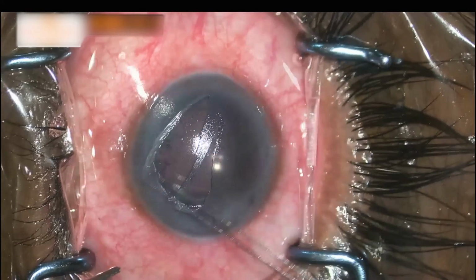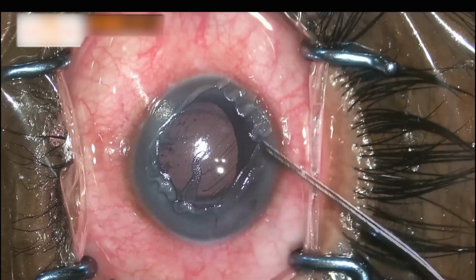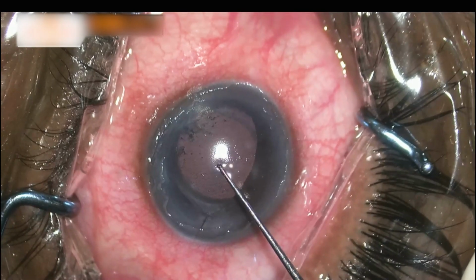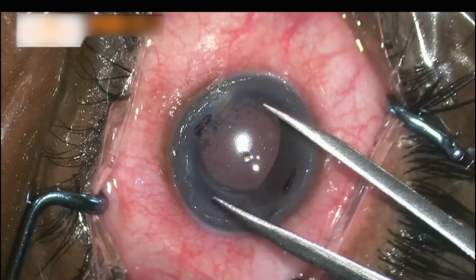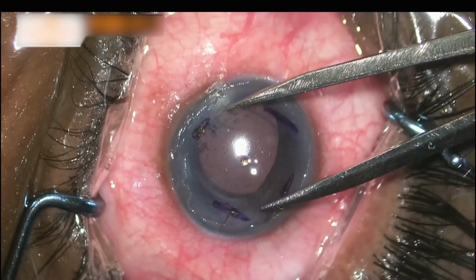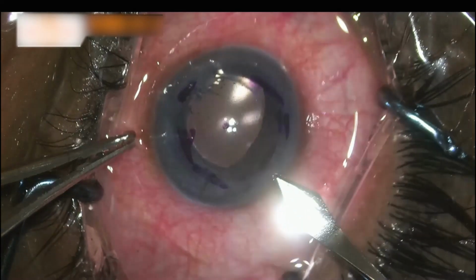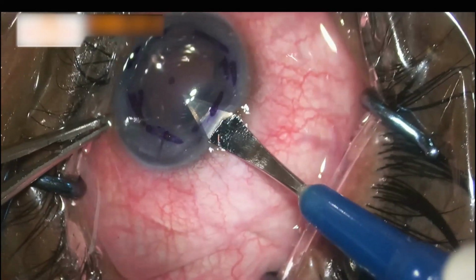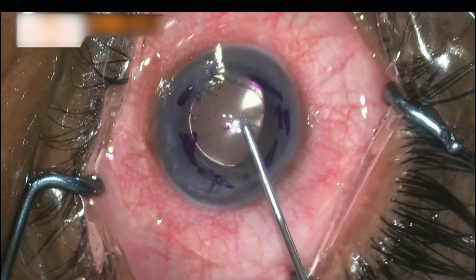Epithelial stripping is performed using a scraper to improve the view of antechamber. Centration is marked and a 7 mm marking is done using a caliper. Corneal incision using a 2.8 mm keratome is made. Viscoelastic is injected to inflate the antechamber.